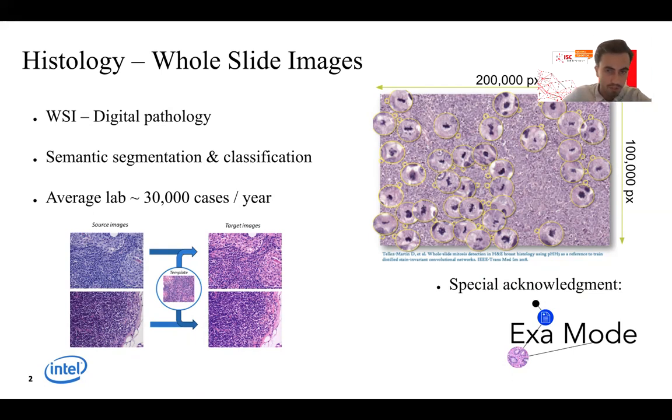The main challenge with these whole slide images is the memory footprint, as these images can be approximately 200,000 by 100,000 pixels, which leads to considerable memory utilization at train time. This also means that conventional training of convolutional neural networks is not possible in data parallel settings, as even a batch size of 1 exceeds commonly used GPU RAM, which adds up on the whole slide image size and the activation maps.